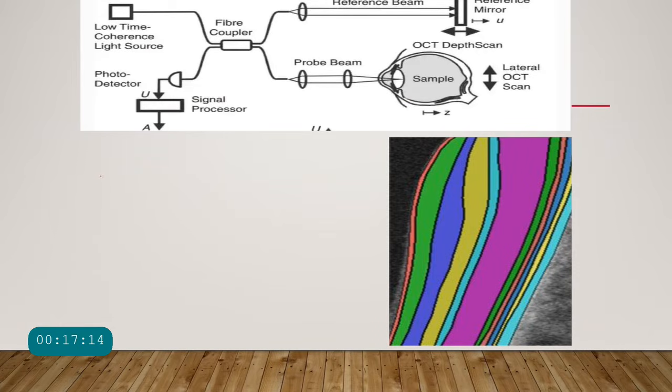So suppose first of all we have this monochromatic source of light which goes like this, in such a way that, say, this is the layer 1. At layer 1 only the crest will form, and at the other layers only the troughs are going to come. As we know, the crest is the part where the maximal intensity of a waveform will exist, so you are going to get signal only from L1, that is layer 1, because over there the crest of the wave is coinciding, and from L2 and L3 you are not going to get any signal.